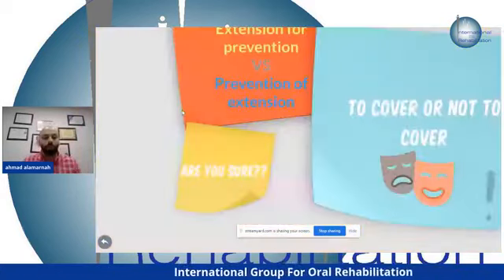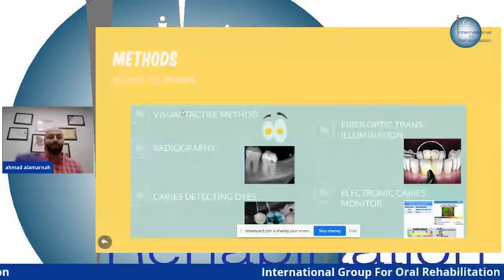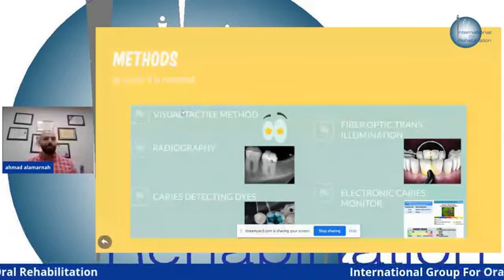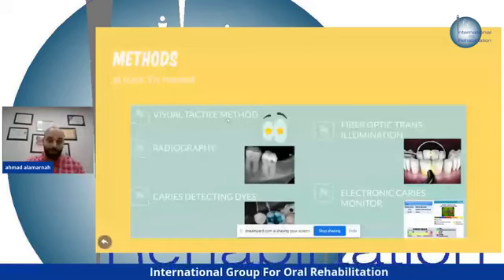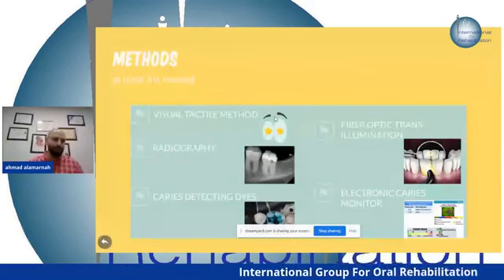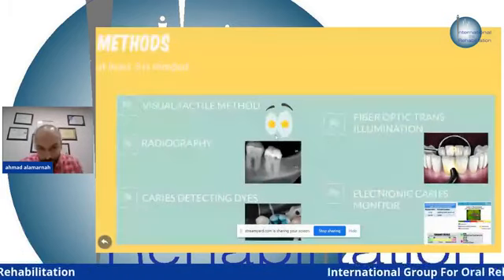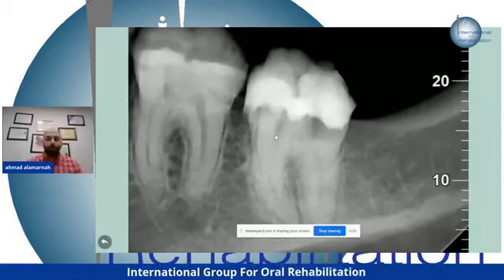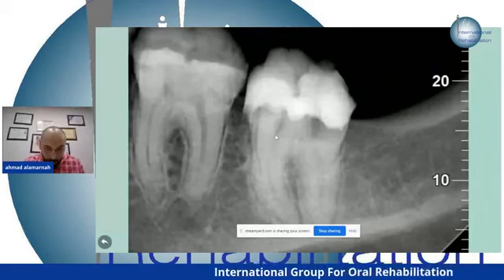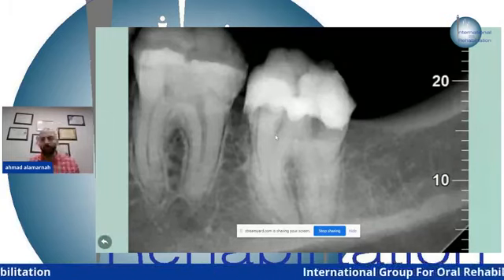So what are we using to know that we are removing only the caries? First of all, you should have at least 3 of these ways to complete your treatment. The first one, which we all have, is the eyes. You see the lesion, you see the brownish stain of the active caries, you see the plaque, you see everything. Second is the periapical X-ray, the bitewing X-ray, or the panoramic X-ray. The most accurate one is the bitewing, but you can diagnose with the panorama or the periapical X-ray.